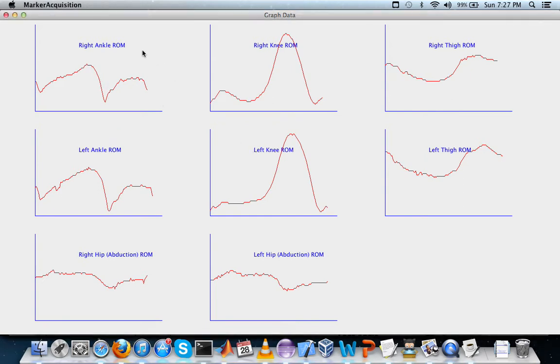The first one is our ankle graphs, and these are actually generated extremely accurately with the calculations done so far. The right ankle range of motion is here, the right knee, the right thigh, and similarly for the left side, and then the abduction angles, which is the movement of the hip along the z-axis. What you see with the right ankle range of motion is anything below this, around this line, is plantar flexion, where the ankle's angle becomes greater than 90 degrees, and above it is dorsiflexion, where it's less than 90 degrees.